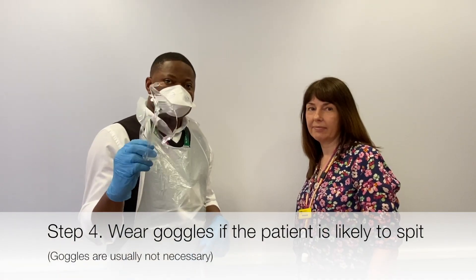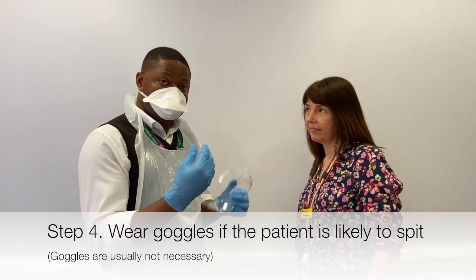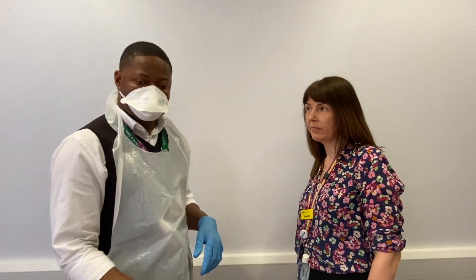You might use goggles if you are worried or concerned about the person spitting, but it's usually not necessary unless your risk assessment indicates there are risks of somebody spitting on you.